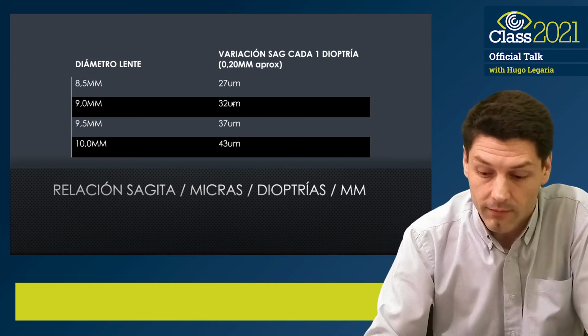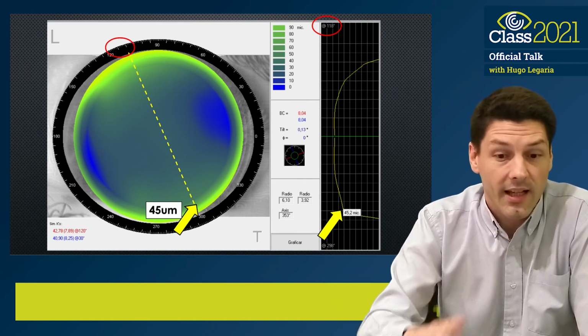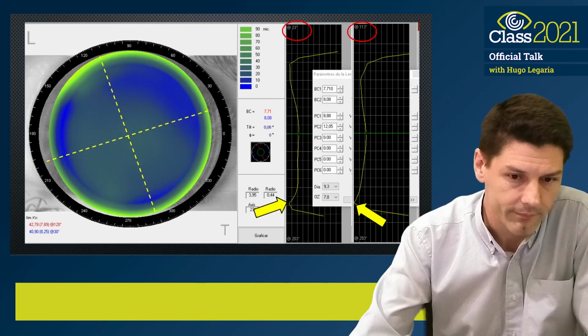So I know that in this case, I could directly adjust the counter axis with respect to the flat axis by 1 diopter, and the lens will practically remain resting fairly evenly on the two main axes.